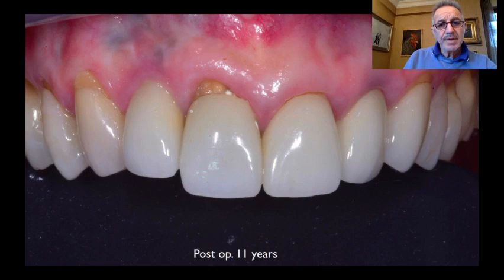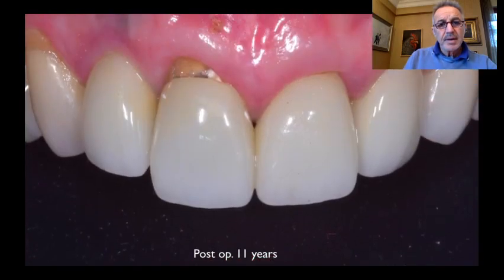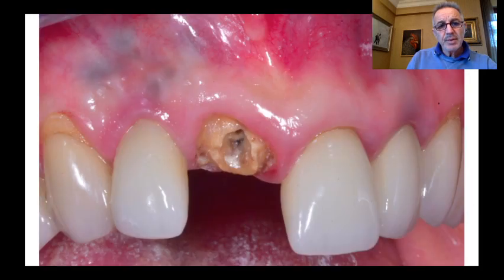There's some amount of recession. This is a 12 o'clock position. And as you can see here, tooth root resection was performed a long time ago, and there is some pin restoration on it. I discussed the situation with the patient, and redoing a fiber post or some other conservative restoration sounded not realistic at that time.